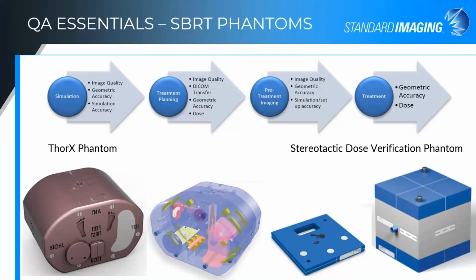Both phantoms use detectors and film for the verification in the workflow that you would have. We do include also in this QA slab a variety of different densities. So again, they're not an organic shape, but they're there. You have the air pocket, the blue water, so water equivalent, and you have adipose fat, trabecular, and cortical bone. So you can do that spot check of your CT densities as part of your QA and your treatment planning system.